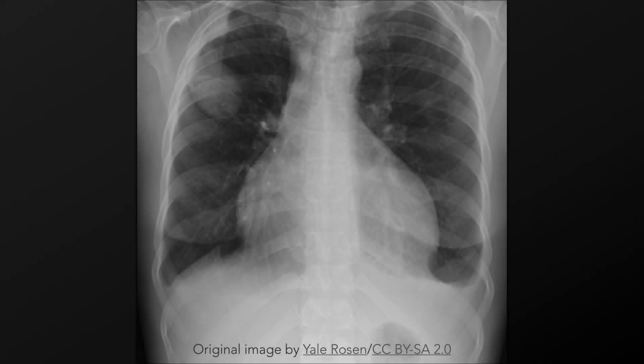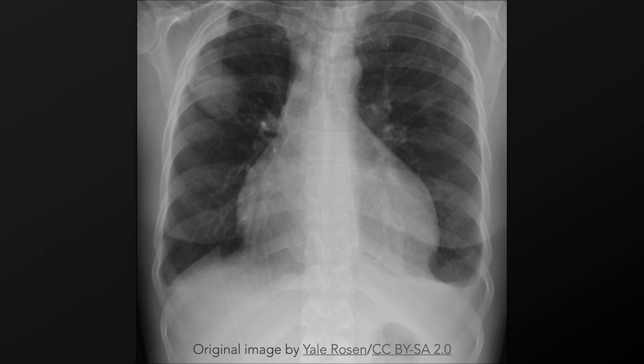Aspergilloma is often manifest radiographically as a focal ovoid and non-speculated opacity, more commonly located in the upper lobes. If liquefaction necrosis occurs, then there may be a central area of radiolucency. A thin-walled area of radiolucency can be found above or surrounding a cavity in Aspergilloma, a finding referred to as the air crescent sign.